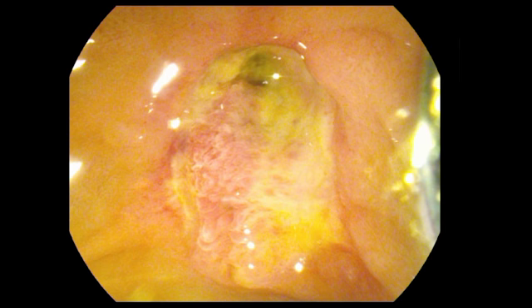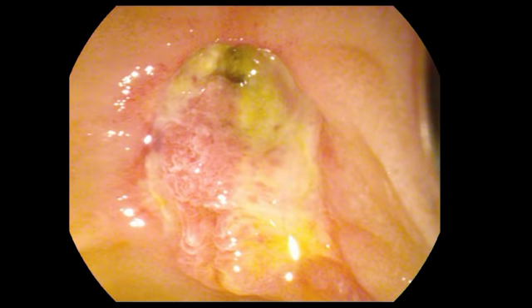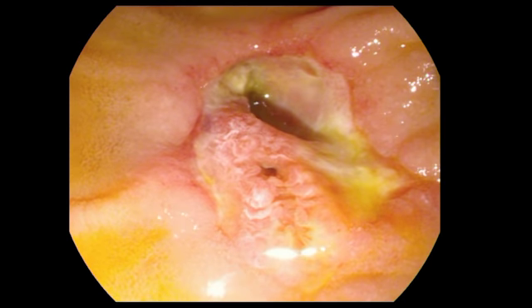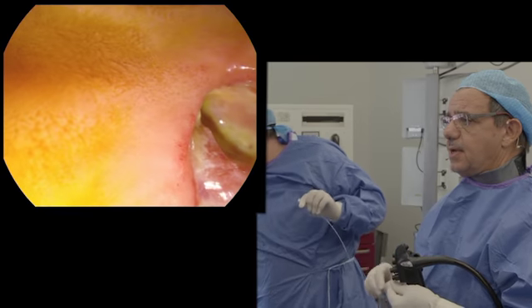And you see this lesion is an infiltrative lesion. There is an infiltration of the bile duct. This is not a candidate for the endoscopic resection. Okay, this is the pancreatic orifice and the bile duct here.